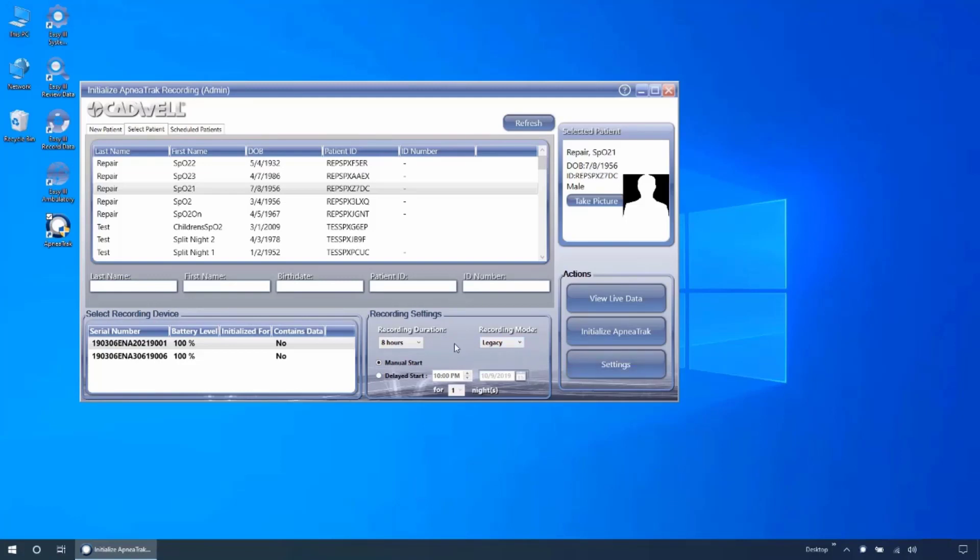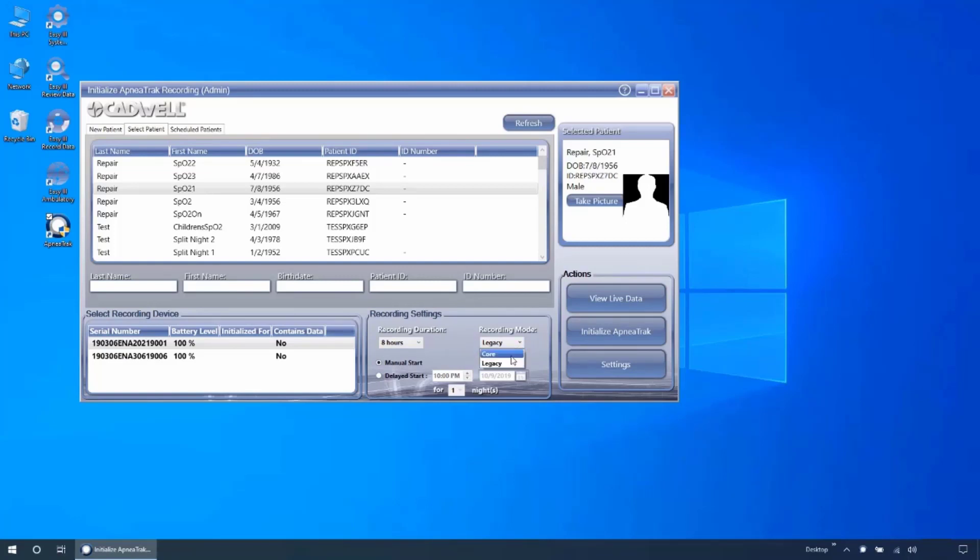Unlike other devices, on the ApneaTrak, once the recording has begun, the study cannot be interrupted unless the device is connected to a computer with ApneaTrak software installed. If you are using a legacy device, the recording mode will allow you to select legacy or core to determine how many channels will be recording during testing.